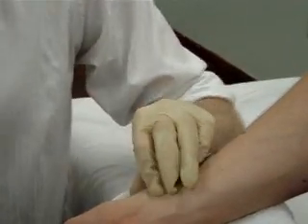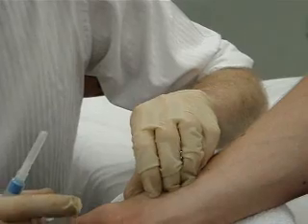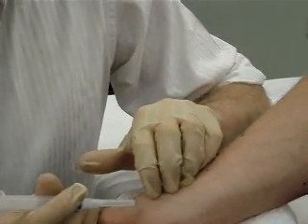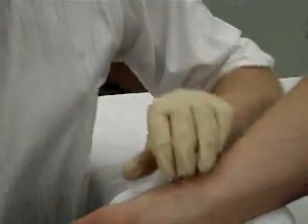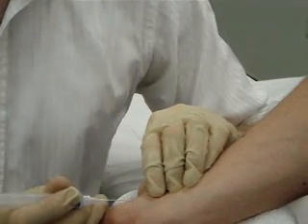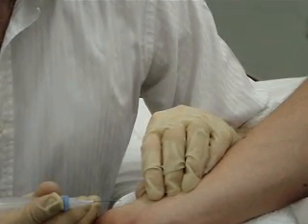I'm just going to palpate the area that I'm going to go in. Using your fingers you need to palpate the maximum area of blood flow from the artery. The easy thing to remember is that you should try and palpate the absolute tip of the pulsation so you can get right in the middle. What I'm doing is pressing vertically downwards to feel the exact point of maximal pulsation. Whilst palpating the radial artery, I don't want to press too hard — if I press too hard I'll actually occlude the artery and then you won't be able to do the blood gas test. So I'm going to press quite lightly to localise the radial artery.